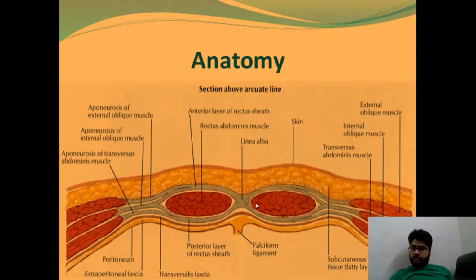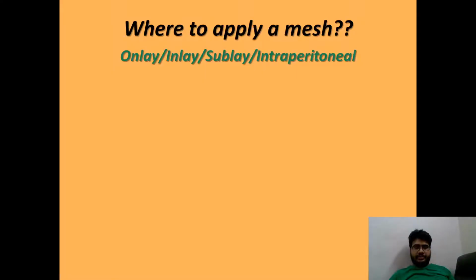Now, we'll proceed further. The ways to apply a mesh are: onlay, inlay, sublay or intraperitoneal. We'll learn them now.